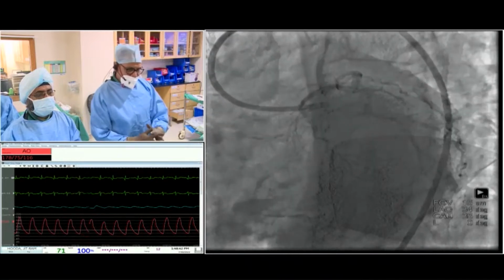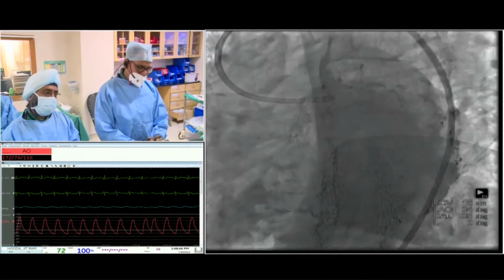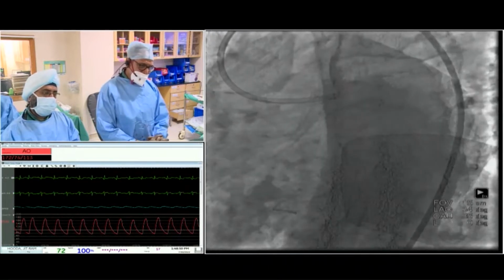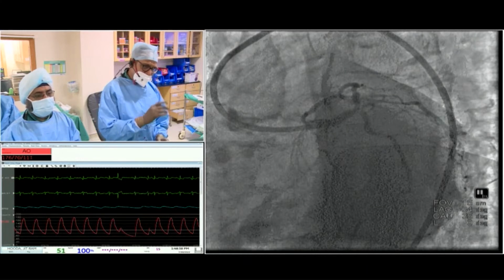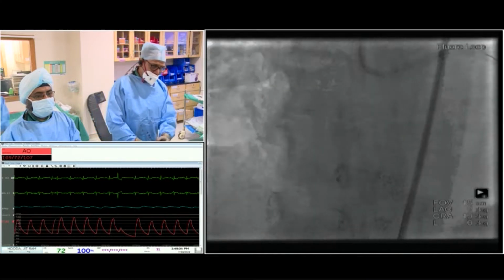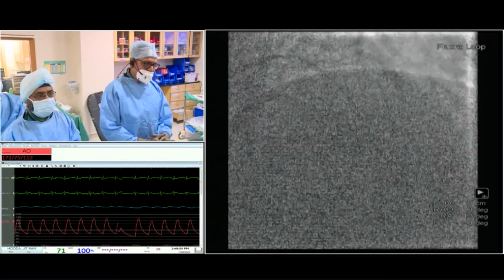So in this angiogram on spider view, we see that the distal left main has significant plaque. Nevertheless, we'll assess it by doing ultrasound. It also has proximal LAD disease, which is extending up to the mid LAD, as we see in the other view. We'll come further. And there's a large sizable ramus, which has proximal long disease. Go to the next one. This shows that we checked some IVUS runs here.